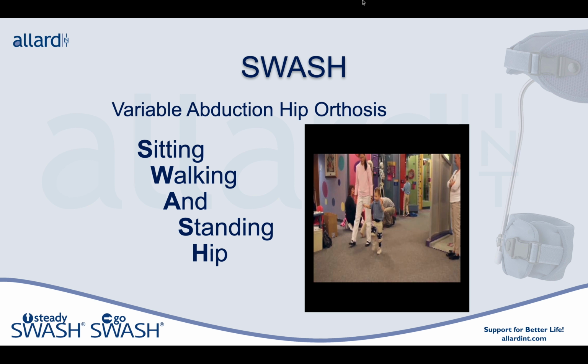SWASH is an acronym for sitting, walking, and standing hip orthosis. It is, again, a variable abduction orthosis. Also think of it as an adductor blocker.